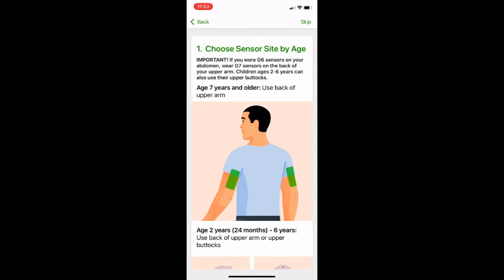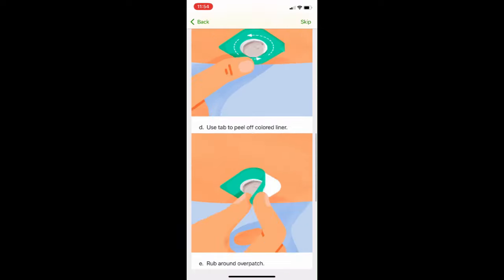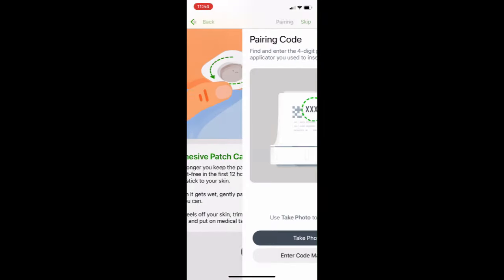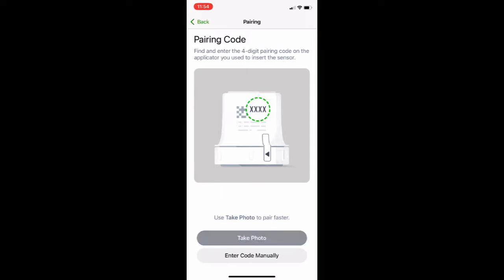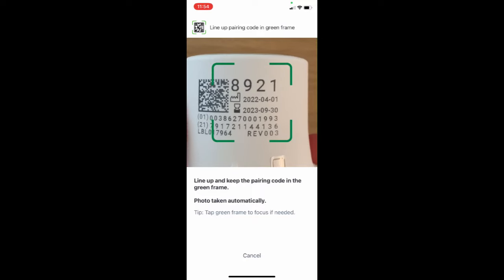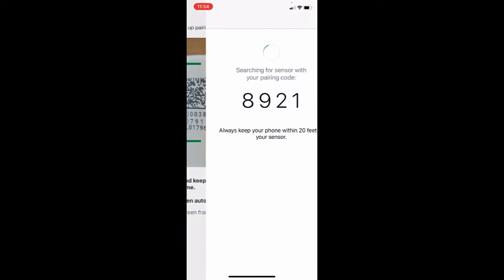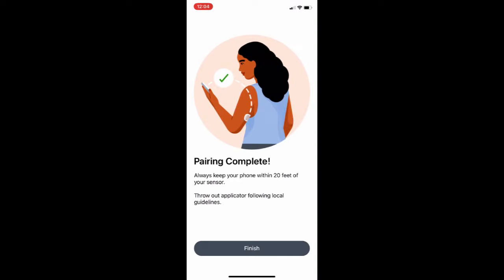The app is going to walk you through what I just showed you, so scroll all the way down to the bottom and click Next. Then it's going to ask for the pairing code — you can take a photo, which is easier. Allow camera access, click OK, and take a photo of your code. When it asks if you want to pair, click Pair. Once it's finished, just click Finish.